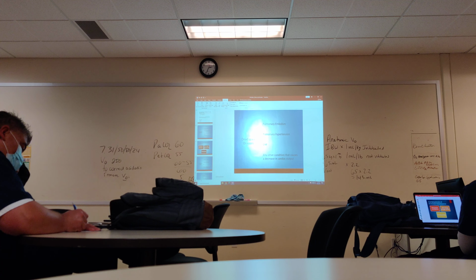Which is pretty high, right? But is it high because I have my tidal volume set too high? I don't know. I'd have to look into it. Okay? But that's just how you do the basic formula.